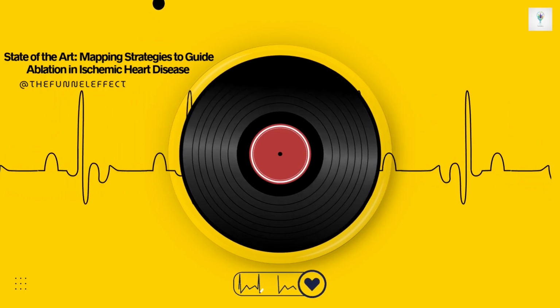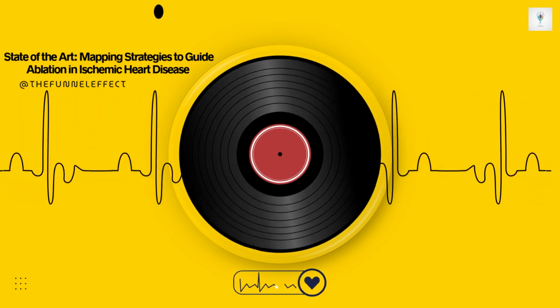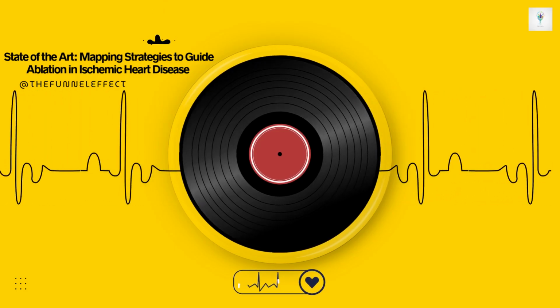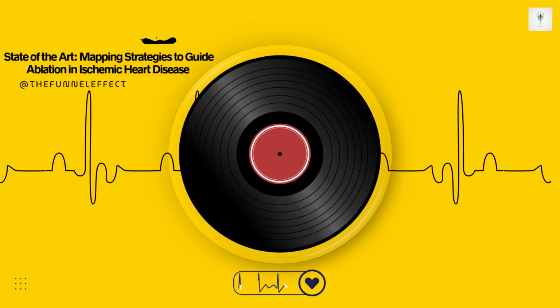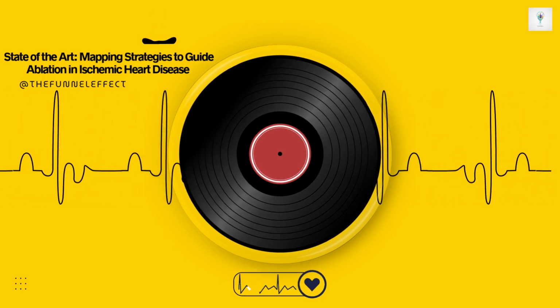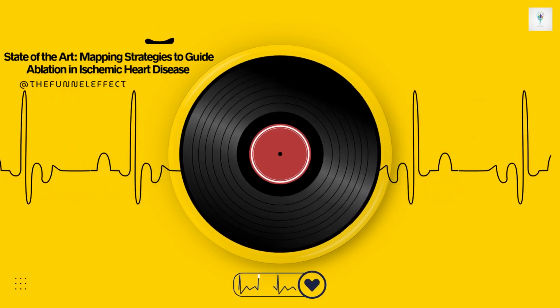One big category is evoked delayed potentials, EDPs. These are signals that literally appear, or get much later, only in response to that premature beat. They weren't obvious in the baseline rhythm. You also hear terms like local abnormal ventricular activity, LAVA, or decrement evoked potentials, DEEP. These are all variations on the theme of abnormal signals revealed by provocative pacing.